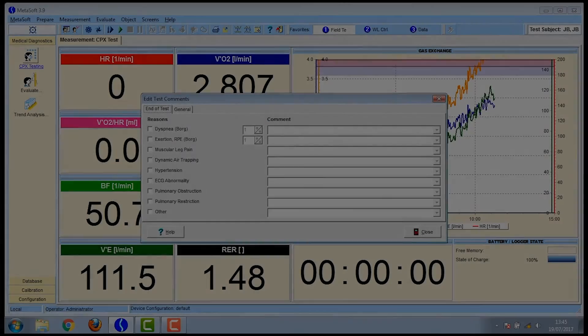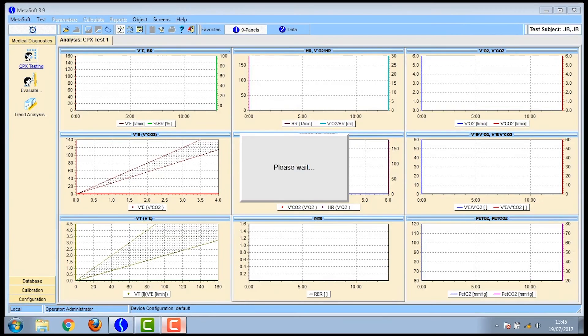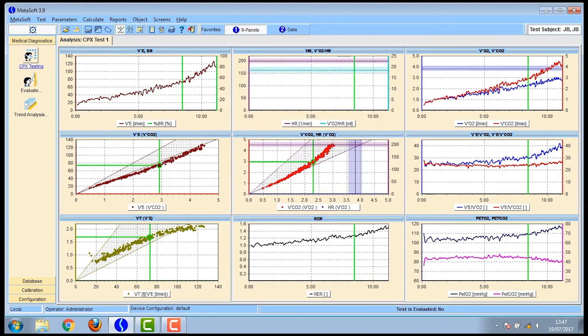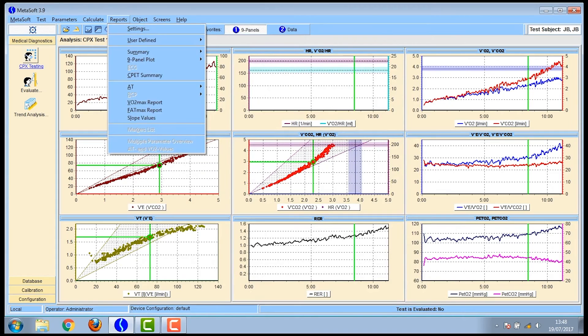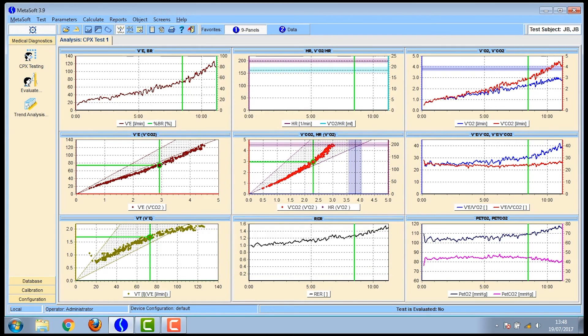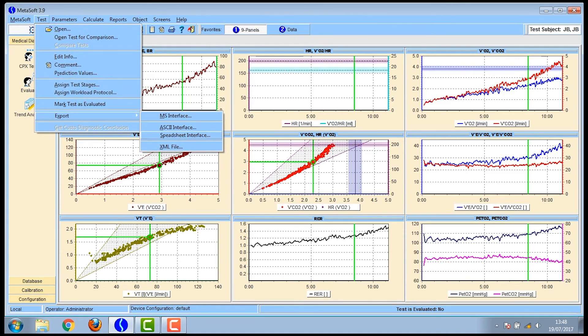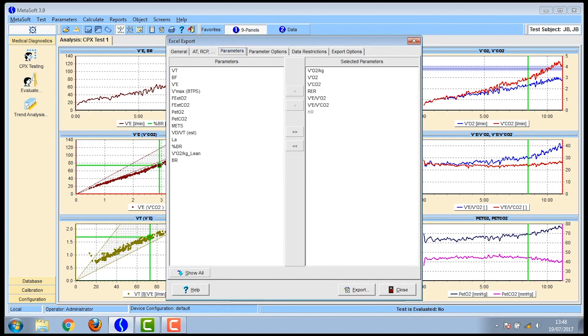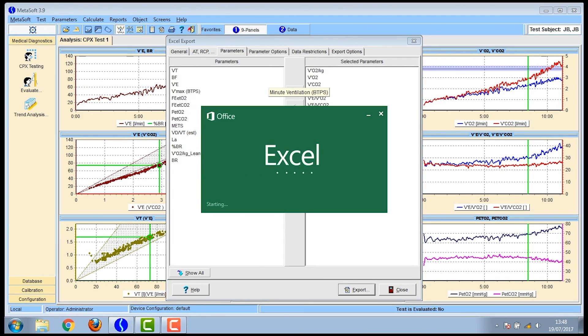Click close in the box and then you're ready to analyse the data. It will always ask about the maximal load — if it's a VO2max test press yes; if it's a lactate threshold test, press no. Then go to calculate VO2max and you can find out their VO2max data from the graph — here you can see it was 37 millilitres per kilogram per minute. To export to Excel, click on test, then go to export and click spreadsheet interface. You'll see the parameters on the right-hand side that will be exported; click export and it opens up in your Excel spreadsheet.